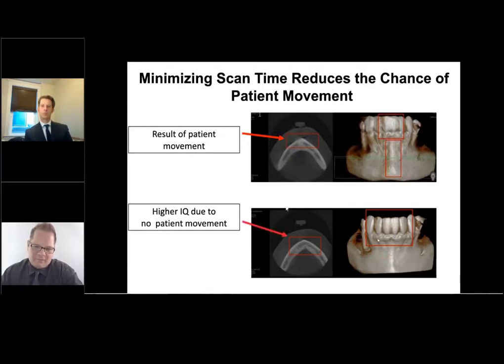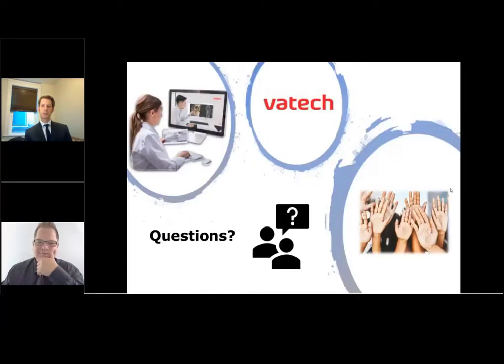You can see the definition of those teeth, the gums, and the dentition very well. Right. So making sure that the patient does not move at all, just stays very still, and the flat occlusion also. Right, right.